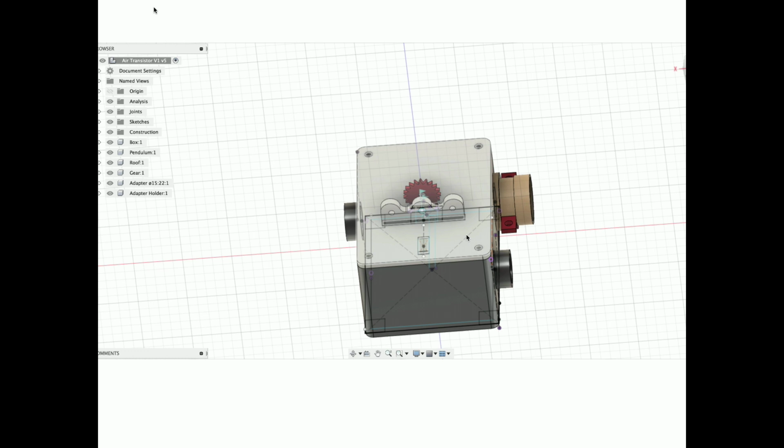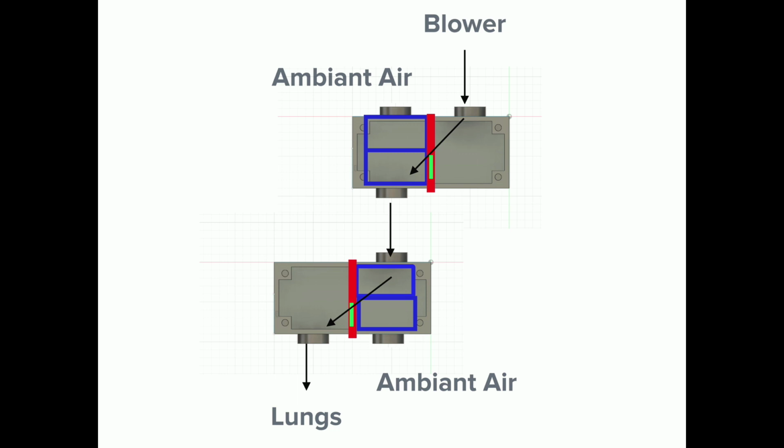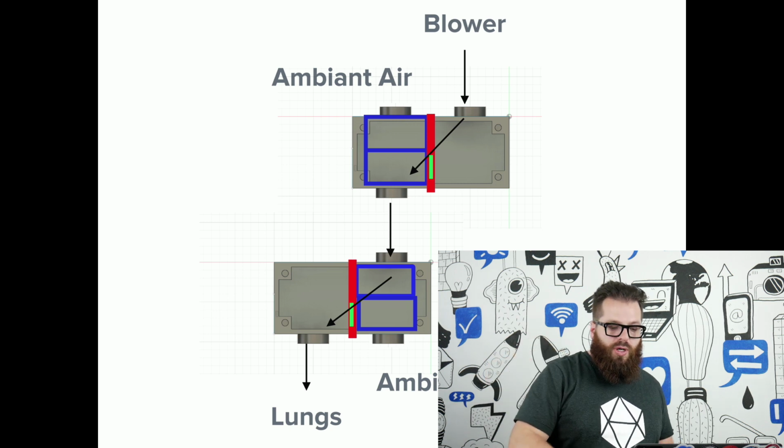And then we push to something we call the transistor, but for the air, which is the ability, with the clapet, to push the air on the side and then decide how much of the air will pass or not pass, and be able to manage pressure on the system from there. So basically the blower pushes the pressure, and if you open all the gates, it goes to the lungs, and as it's a clapet, you can have a variable pressure here.